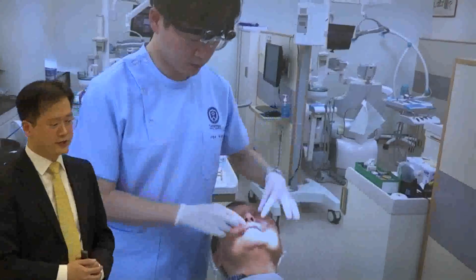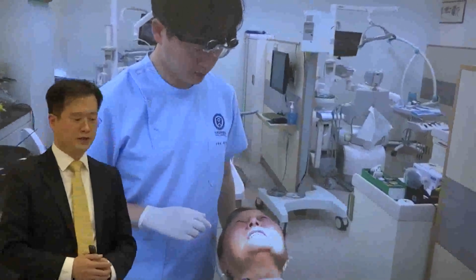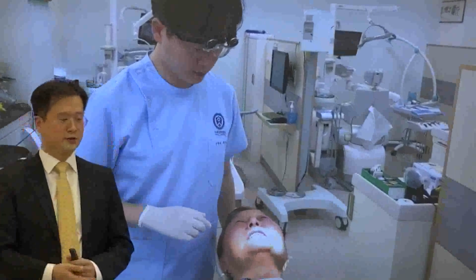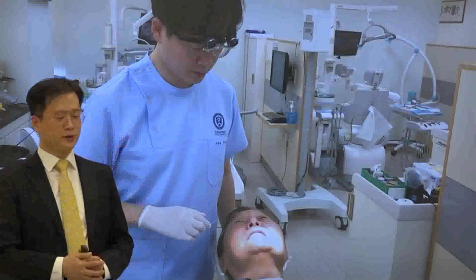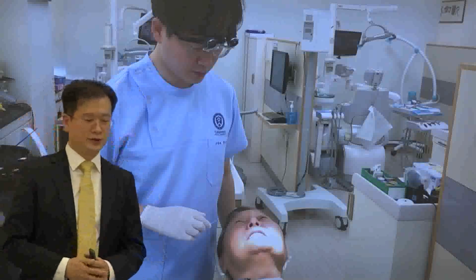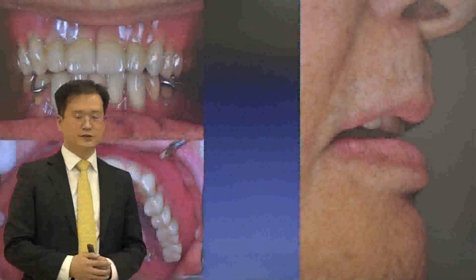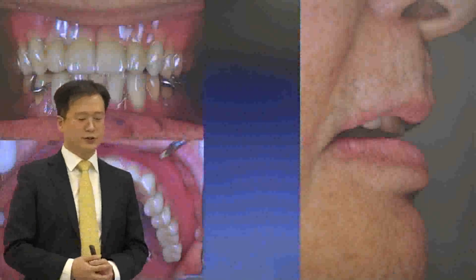I'm asking the patient if the occlusion is the same on the right and left side. I'm also asking whether it is painful when he bites firmly with the new denture in the mouth. The occlusion of the zirconia teeth was in a harmonious state, and there was no need to adjust the tissue surface. He said he was satisfied with his digitally manufactured zirconia occlusion denture.